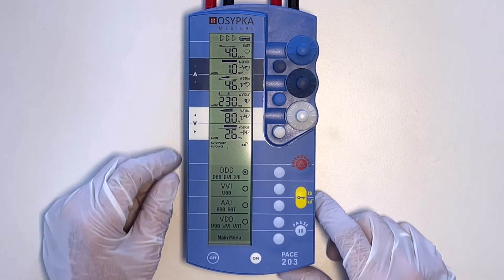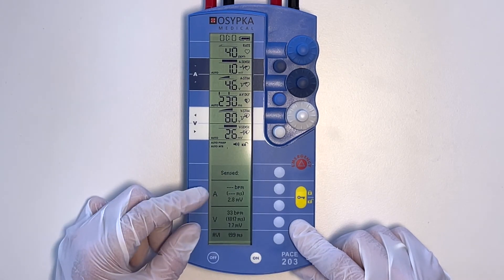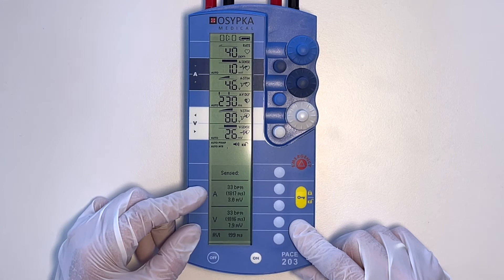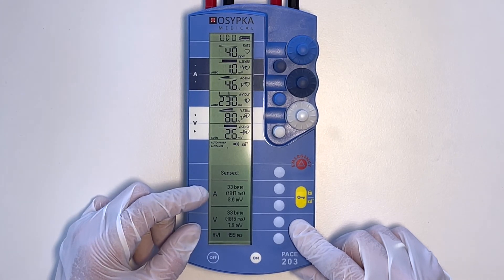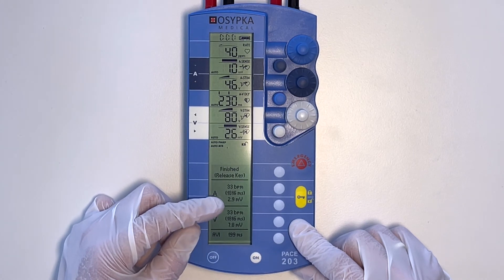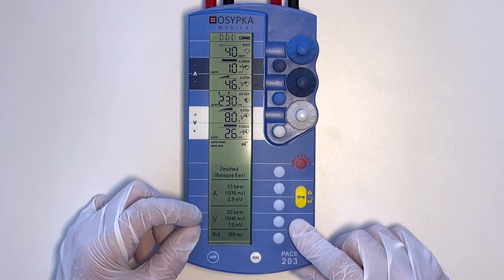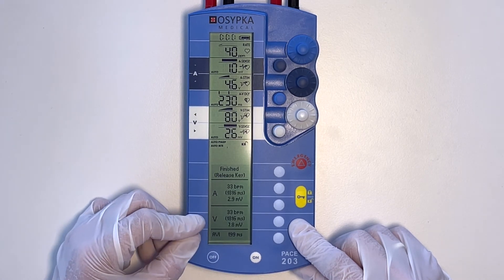If you activate and hold the pause button, after a short time measured values are shown in the display. 'A' stands for the atrium — atrial heart rate, with the corresponding PP intervals in milliseconds. At the very bottom is the value for the P wave amplitude in millivolts; the value here is 2.9 millivolts.